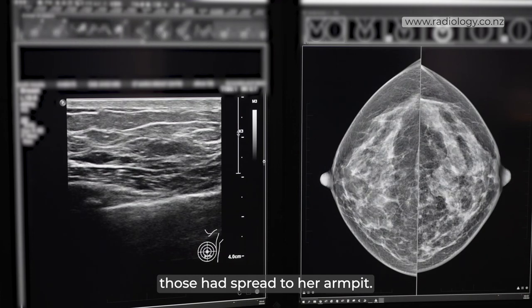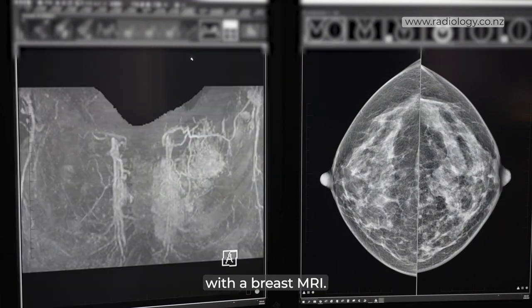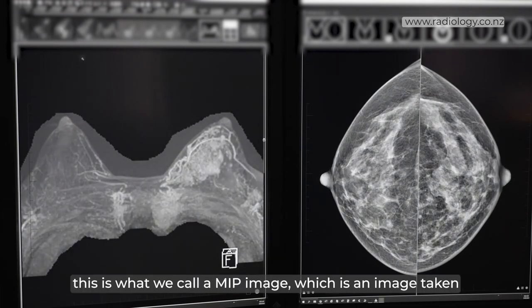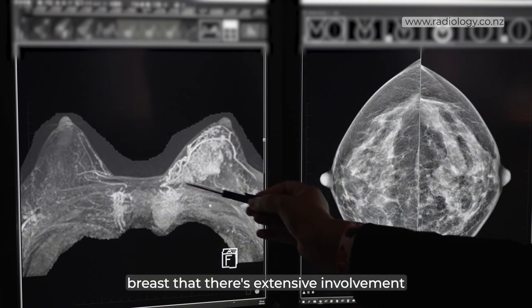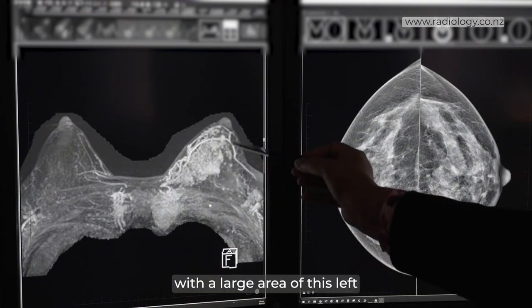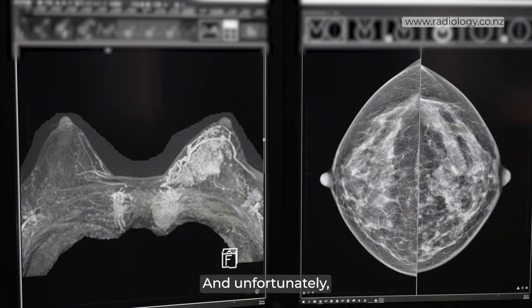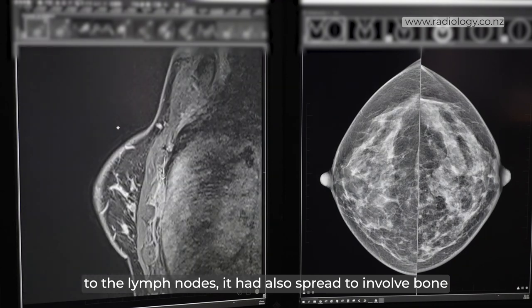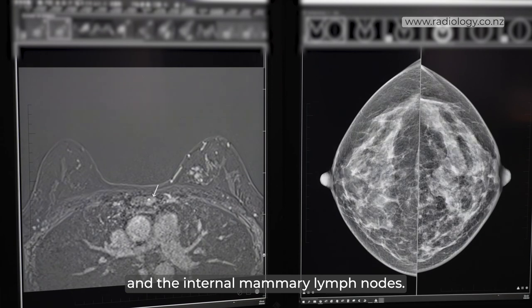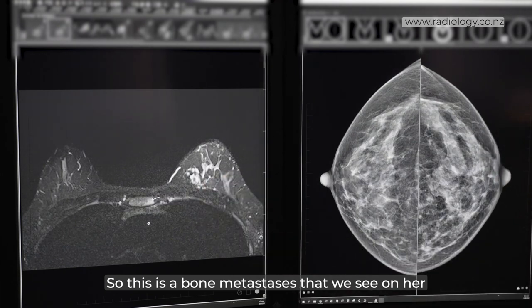Because she already had lymph node spread, we did further staging with a breast MRI. The MIP image shows all contrast-enhancing areas within the breast — you can see extensive involvement of the left breast with a large area of cancer, as well as lymph nodes in her left axilla. Unfortunately, because of the tumor size and lymph node spread, it had also spread to involve bone and the internal mammary lymph nodes, seen as a bone metastasis on her breast MRI.